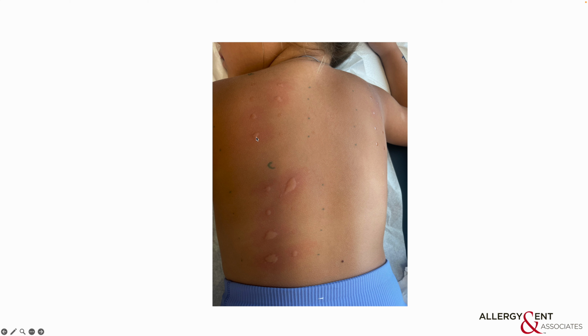You won't need to measure anymore eventually, but at the beginning you want to use a ruler and measure them. Once you get used to it, after hopefully about 2-3 months, you won't need to carry the ruler. You can just read it. That's a 0, 0. And then you got this one, it's 5 over probably 15. I read so many of the tests, so I get used to it. I know this is about 5 over 15, so that's a perfect 2.